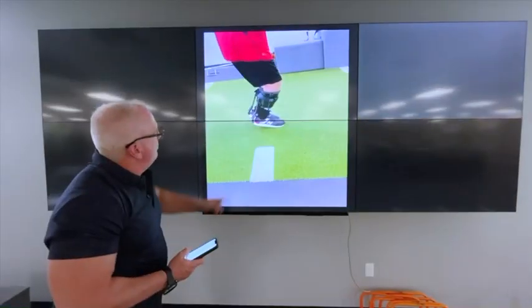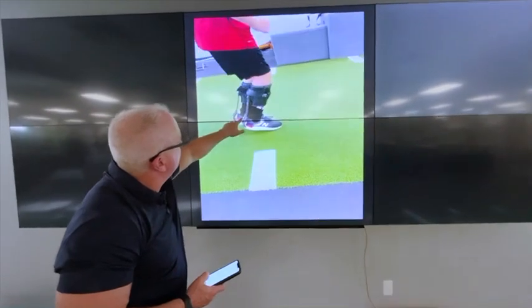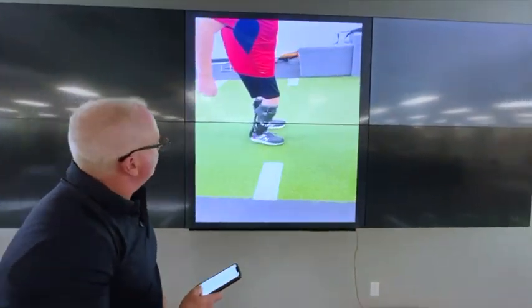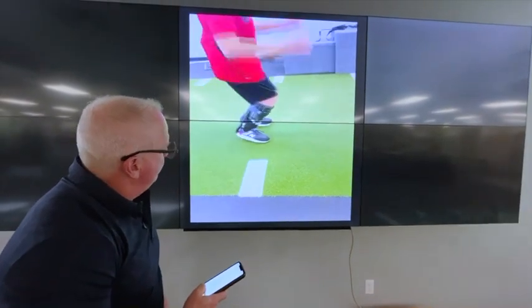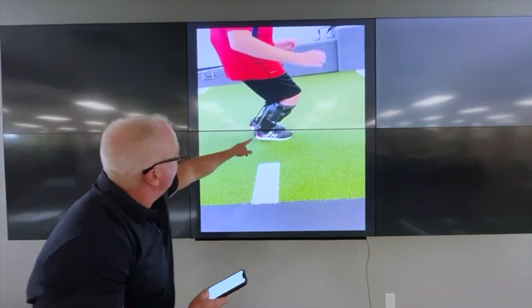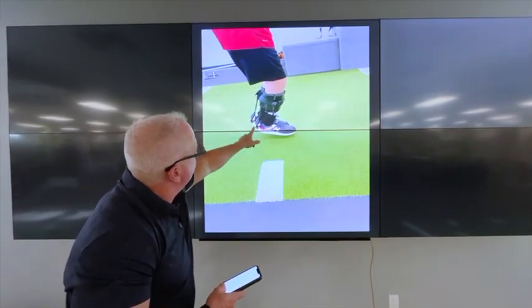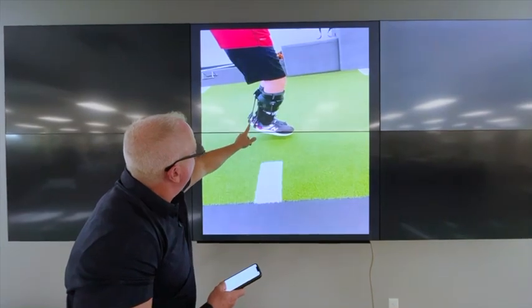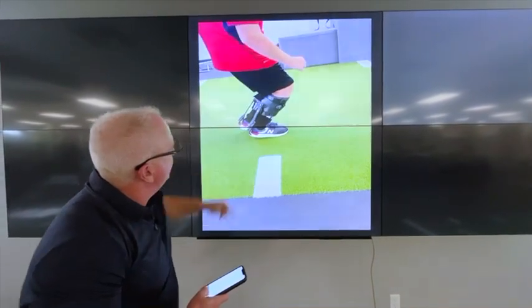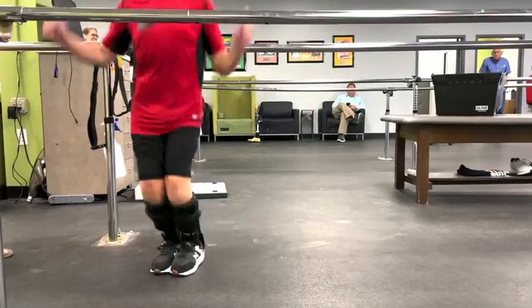Good. See in slow motion how the strut and the toe keel are coming together when he bounces on it. So you can kind of see when he goes up into here and starts bouncing on it, you can see how this closes up, and then it opens back up as the energy is being returned. And then when he comes back down, you can see how this is narrowing between the foot plate and the shoe. Then it opens back up here.